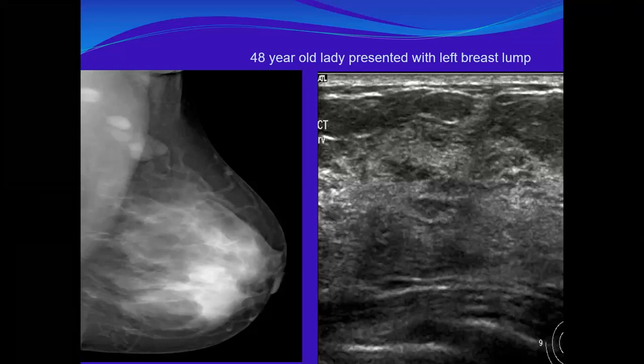In this patient, we went for ultrasound and asked the patient to target the palpable abnormality, and we put the probe. Can you see the abnormality? I can see abnormal breast architecture, a hypoechoic area that does not have a certain shape, non-parallel.